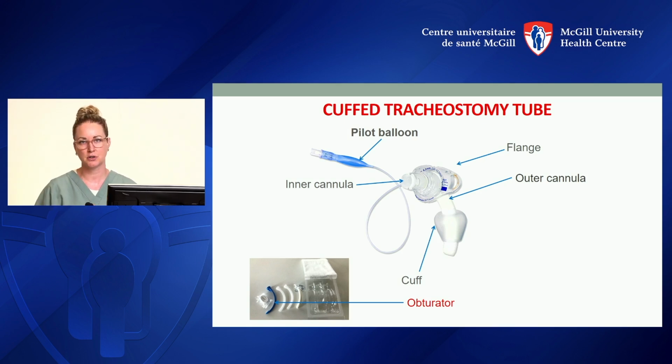Pretty much all patients will start off with a cuffed tracheostomy tube on initial insertion, and that's mostly because they will need mechanical ventilation or they've required some type of surgery, because this is usually done in an emergency situation.